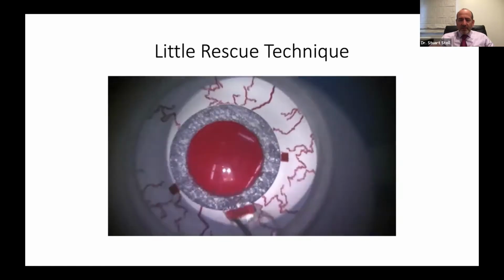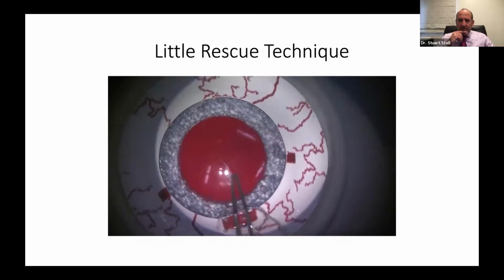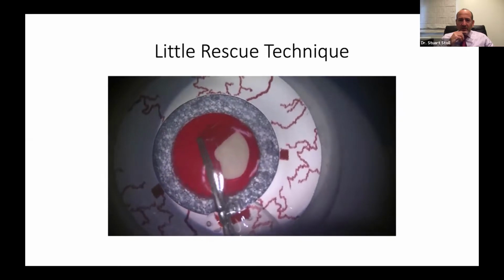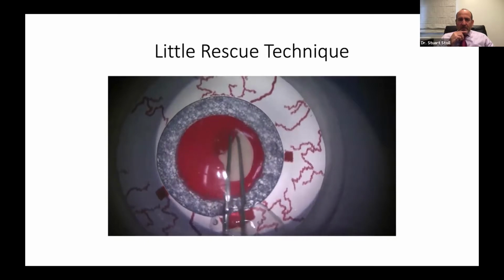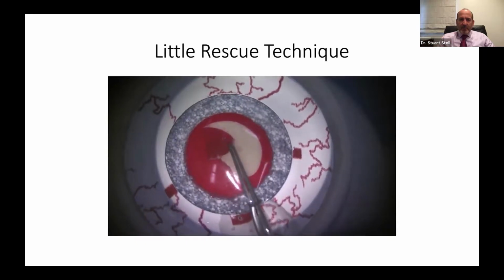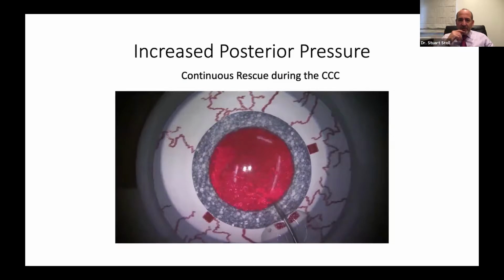Here's one last demonstration of the little rescue technique. And we're bringing it around. Regrasping, walking it out, and rescuing. There it is. Okay. So what if we have increased posterior pressure?